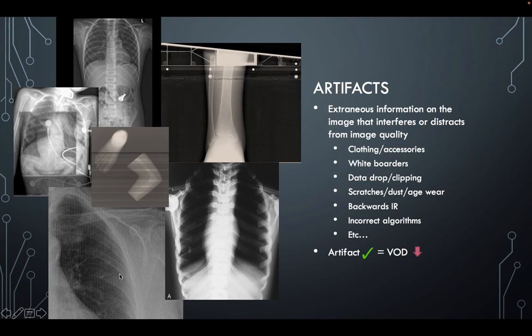And then as far as DR plates, you're going to have to repeat this. And you're going to have to either add a grid and adjust technique, or you're going to have to adjust the algorithm that it's run under. As far as spatial frequencies, I'll be honest with you, I don't even know how to change that. But I will definitely do my research to find out more.